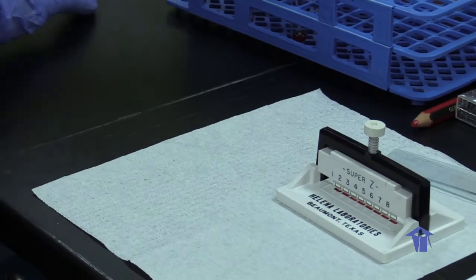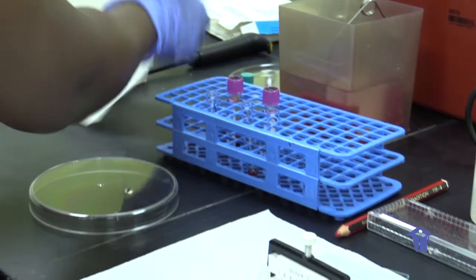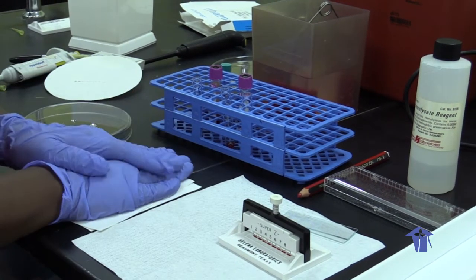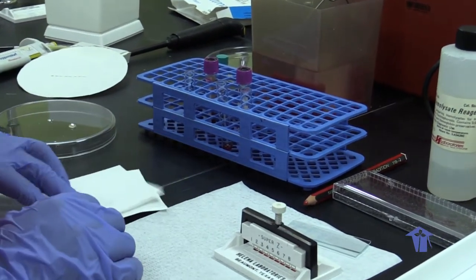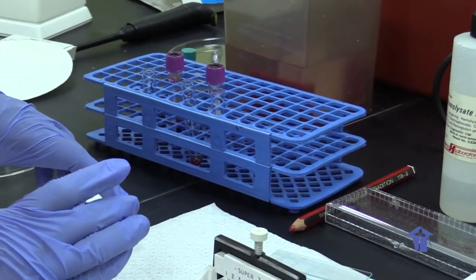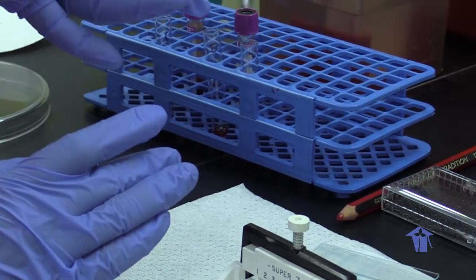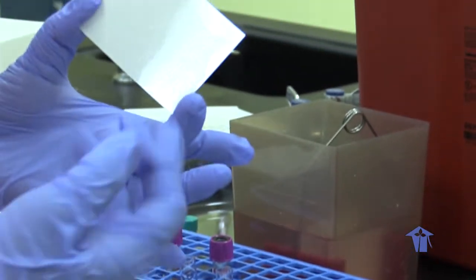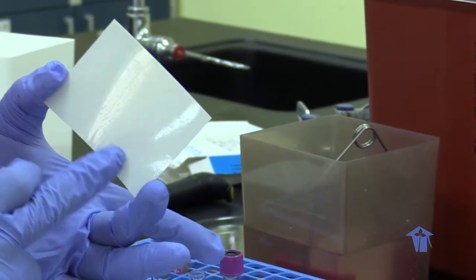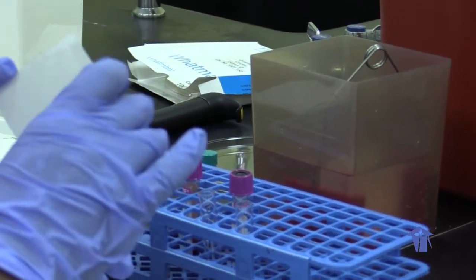Then we take out our plates. We blot dry them. This process here now is to obviously get rid of any excess buffer on the plates, and also to be able to see which side is our acetate side and our glossy side. This is the side that we're going to label, so as not to mistake the acetate side from the glossy side.